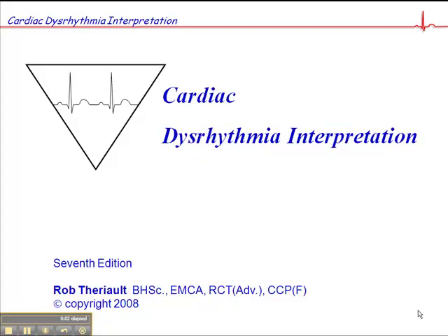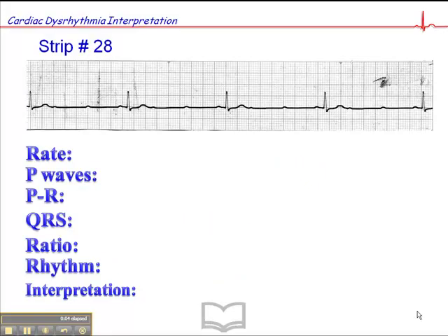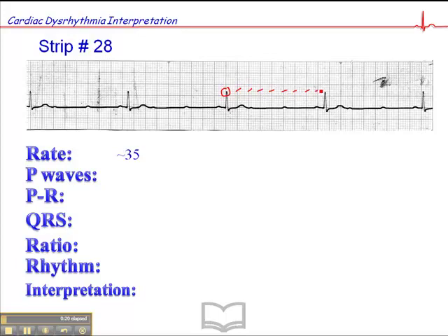Turn to page 98 — this is exercise 28. We'll start with the rate, which is approximately 35. If we map it out, here's a QRS that falls on a dark line. So the heart rate sequence is 300, 150, 100, 75, 60, 50, 43, 37, 33. So somewhere between 37 and 33 — in my book, that's about 35.